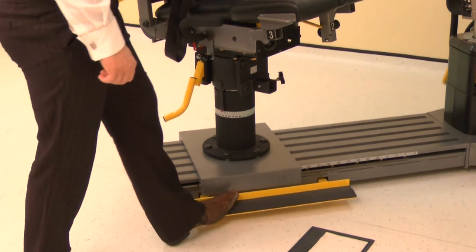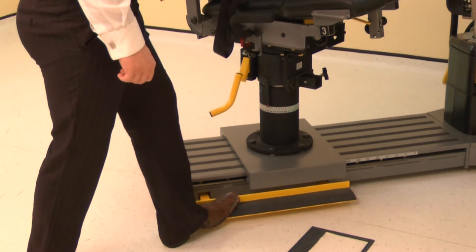Finally, position the monorail by pressing the kickboard and sliding the chair to position 32.